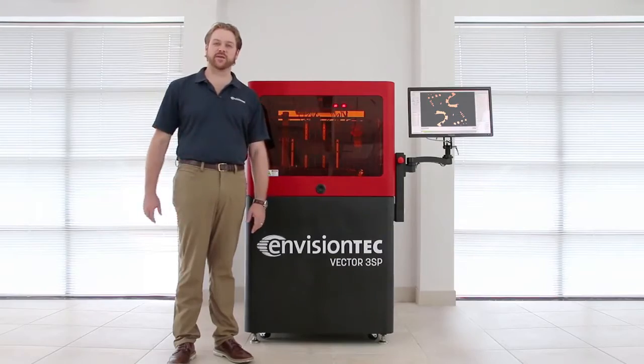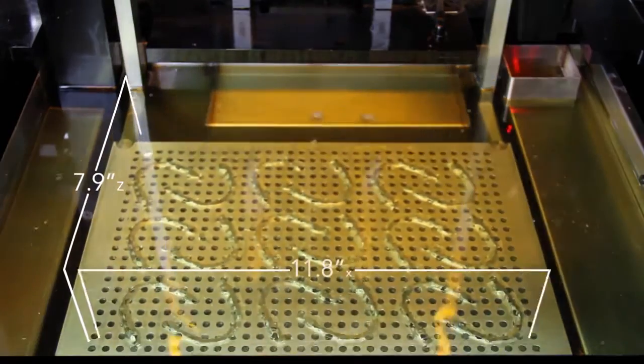Hi, this is Chris Cabot with EnvisionTech and I'm standing here with the Vector3SP, a large frame model 3D printer for both the orthodontic and dental laboratory.